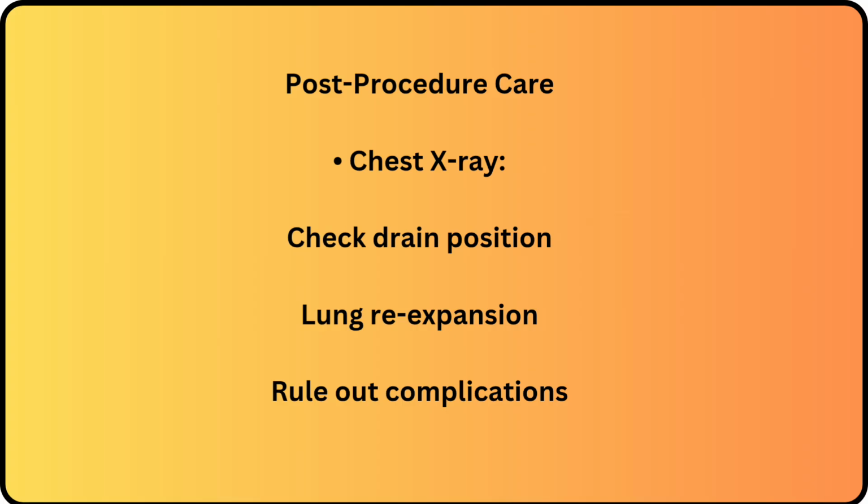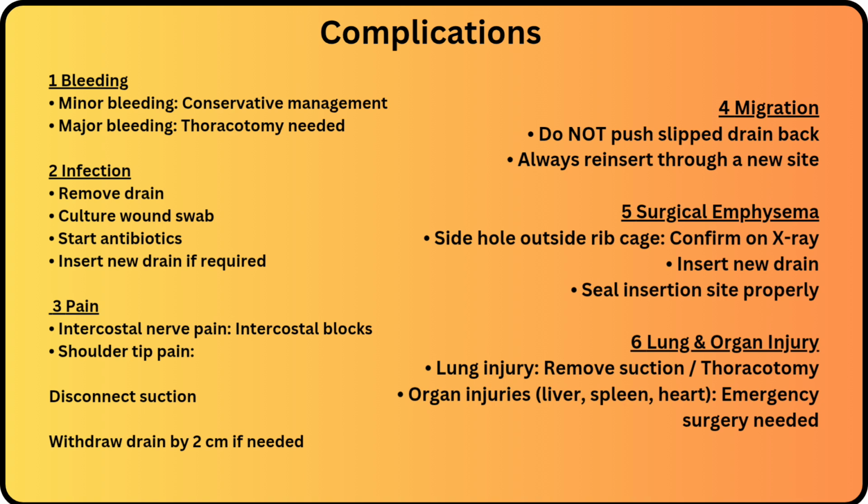Post-procedure care. After insertion, take a chest X-ray to check the drain position, lung re-expansion, and rule out complications. Complications. Bleeding. Minor bleeding is managed conservatively. Major bleeding requires surgical intervention like thoracotomy.